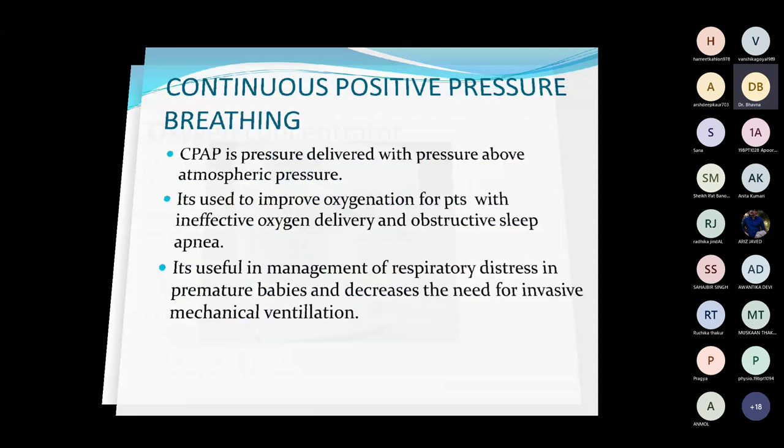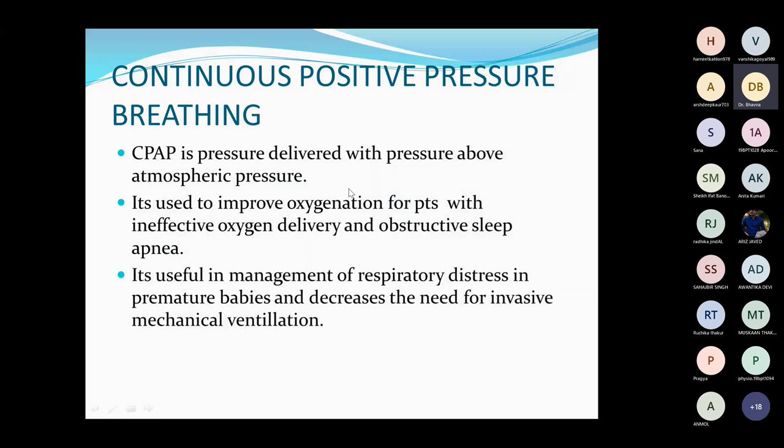So coming on to the CPAP, with the oxygen therapy. CPAP is continuous positive airway pressure breathing. It is pressure delivered above the atmospheric pressure, which is the normal pressure usually required. What was the basic atmospheric pressure, which we started with in the first slide, which is required by the human body? Can anyone answer? Unmute and speak.